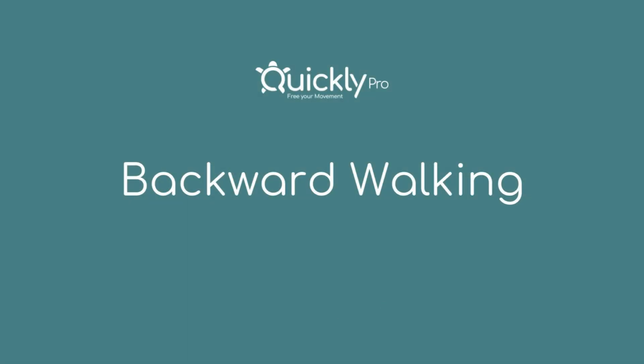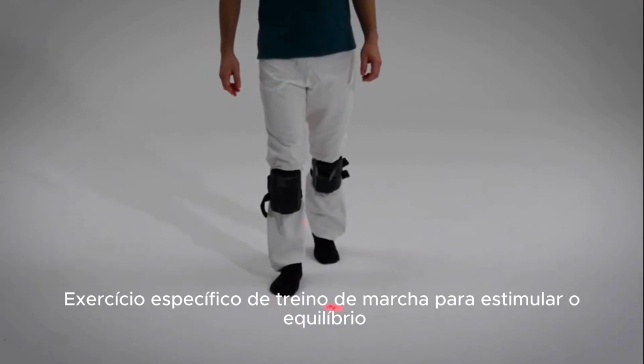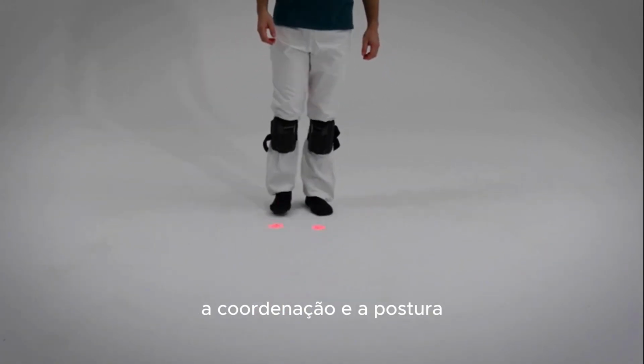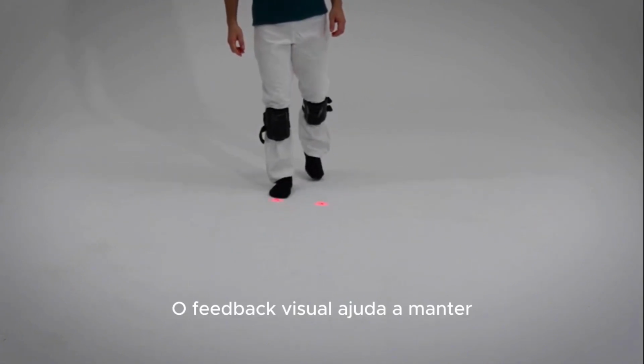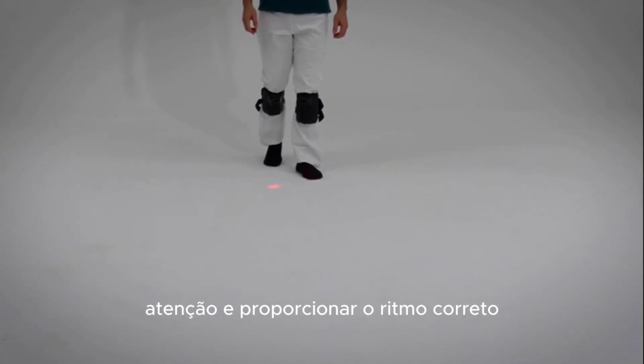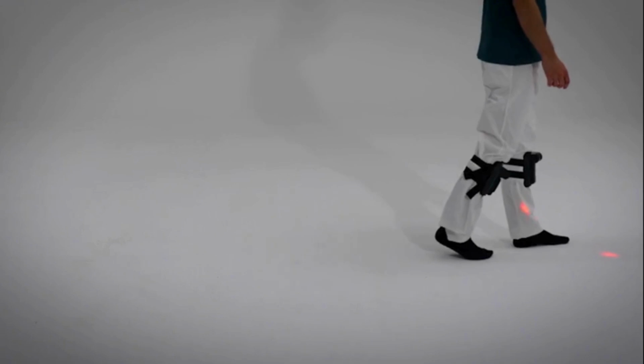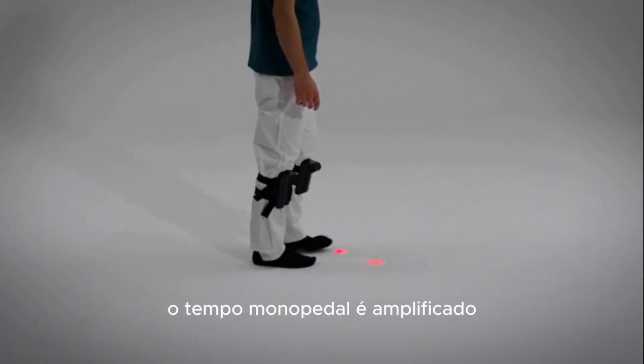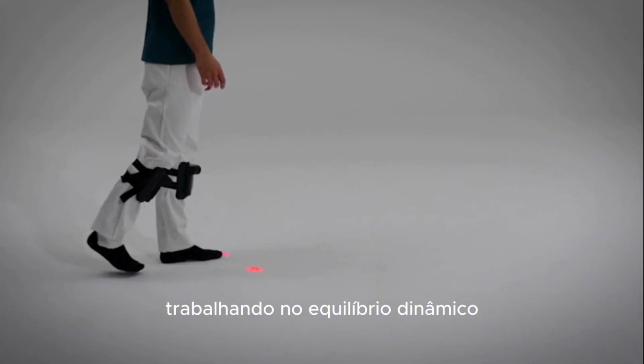Backward walking. Specific gait training exercise to stimulate balance, coordination, and posture. Visual feedback helps maintain attention and provide the correct rhythm when performing the gesture. By reducing the speed of execution, the monopedalic time is amplified, working on dynamic balance.